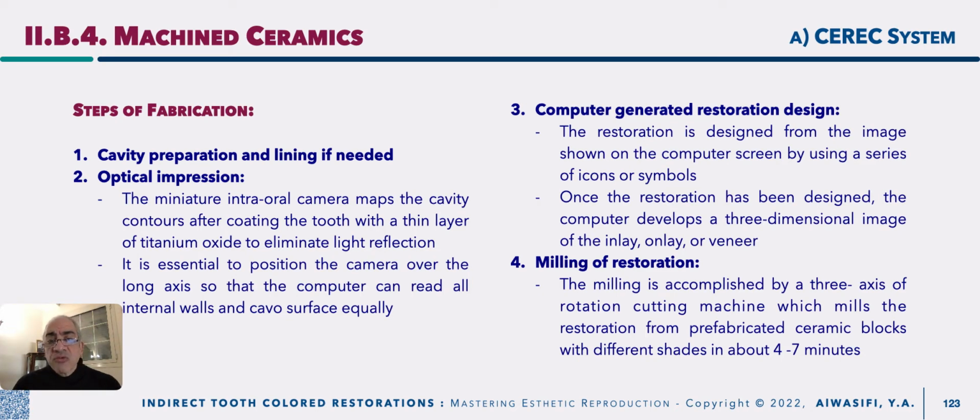Then your photograph of the details or cavity details are transmitted to your software, where you could generate your restoration design. Okay, you could review your design and correct it in different directions, in 3D directions. According to the software you use, it could propose a design and propose a correction, and then you are reviewing it and you have all the freedom to accept this design or not, or to correct it.